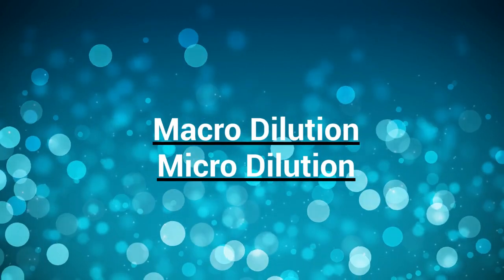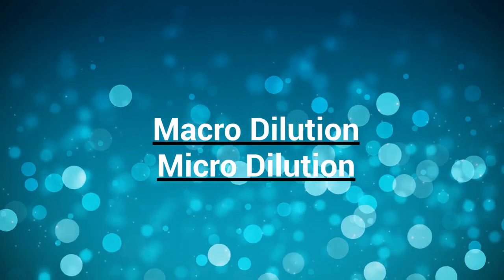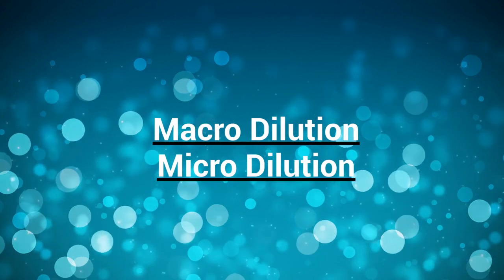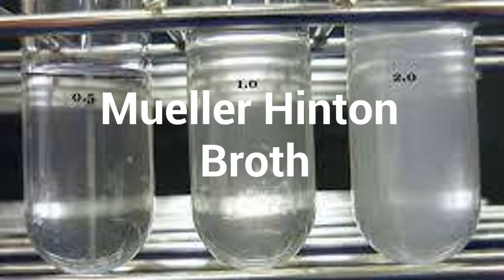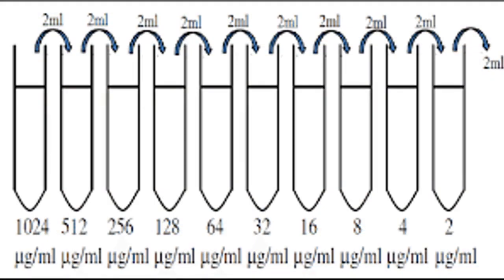Two basic types of dilution methods are macro dilution and micro dilution, and in both we can use either broth or agar method. In the broth dilution method, we use cation adjusted Mueller-Hinton broth for non-fastidious organisms and Mueller-Hinton broth with 5% lysed horse blood for fastidious organisms. We make serial dilutions of antibiotics in it, for example 2 micrograms per ml, 4 micrograms per ml, 8 micrograms per ml, and so on within the therapeutic range of the drug.